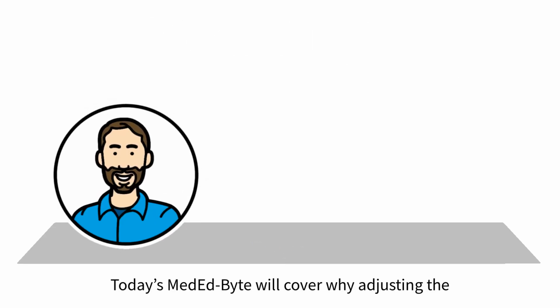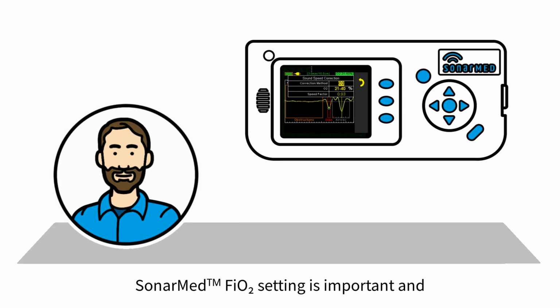Today's MedEd Byte will cover why adjusting the SonarMed FiO2 setting is important and how and when to make those adjustments.